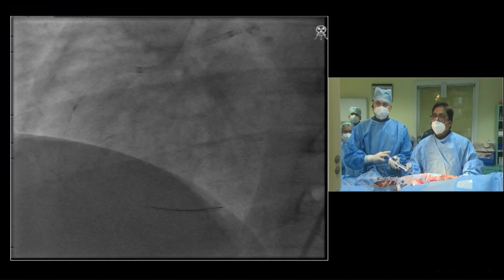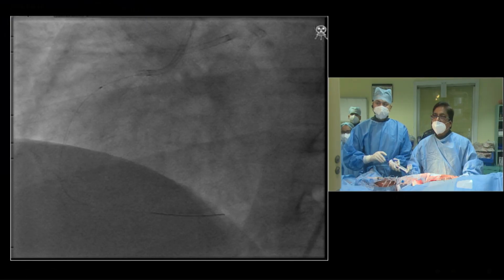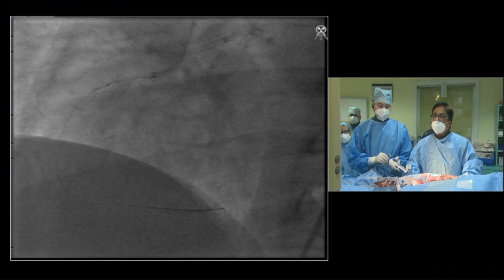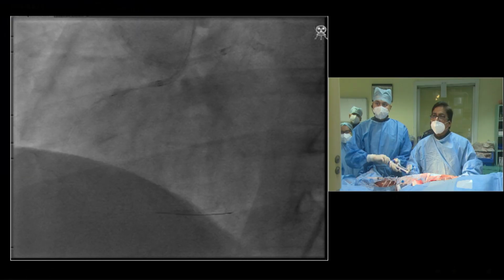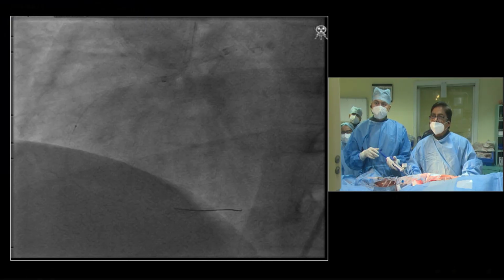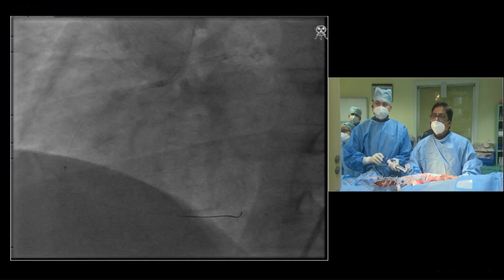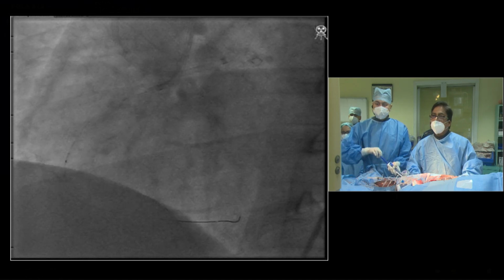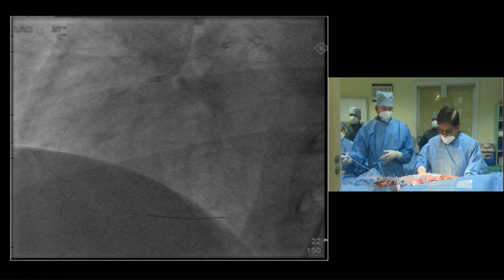Down. Balloon, please. Down. Up more. It's not opening, is it? Down. Because the proximal cap was the toughest cap he felt, that is why he wanted to create his balloon. Down. I think this balloon is ruptured. I don't know, not sure. Let us see.